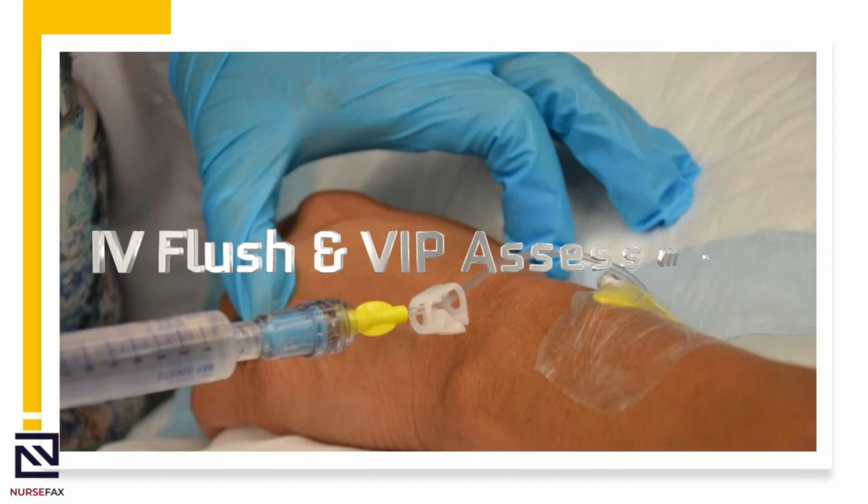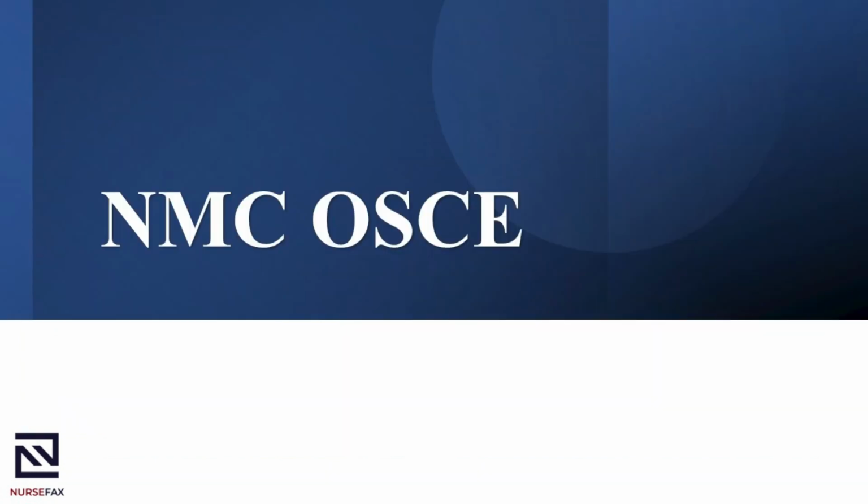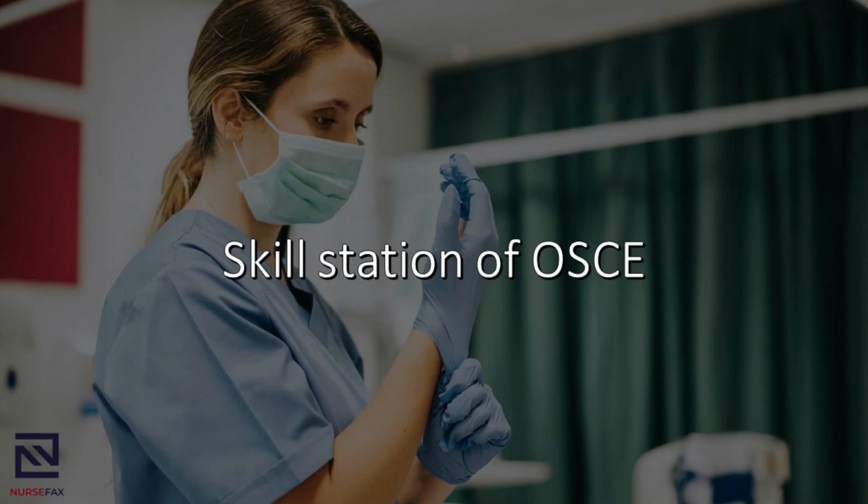Intravenous Flush and Visual Infusion Phlebitis (VIP) assessment is a skill station newly added to the NMC OSCE in 2022. This could be one of the 4 skill stations you can expect on the day of the OSCE examination. This skill station is performed as follows.